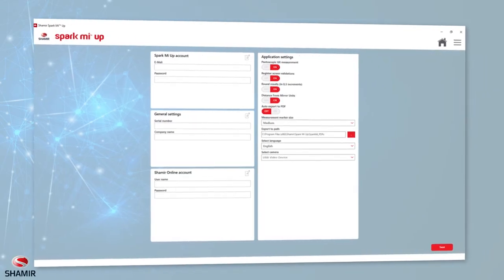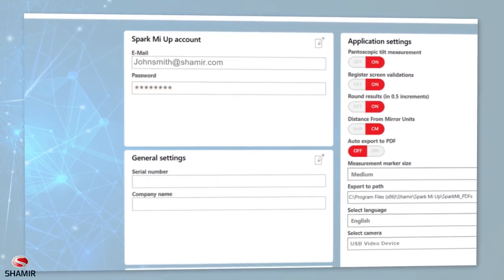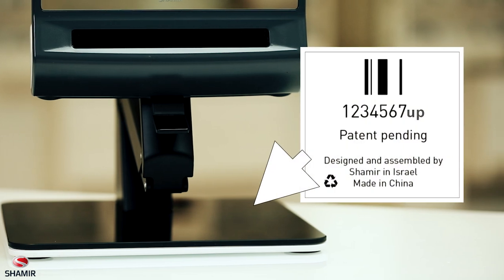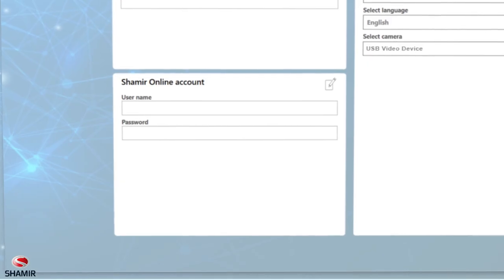Upon launching the application, you'll be able to define your app settings. Make sure to provide your email, credentials, and your product serial number, which is located at the bottom of your SparkMeUp device. If you already have a Shamir Online account, select the checkbox and type in your Shamir Online account credentials.